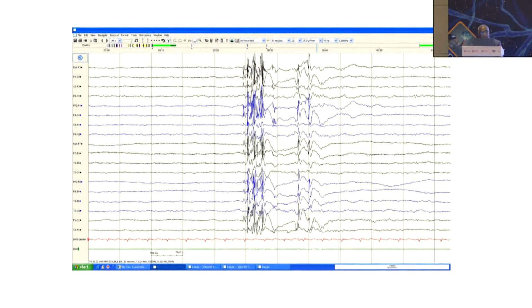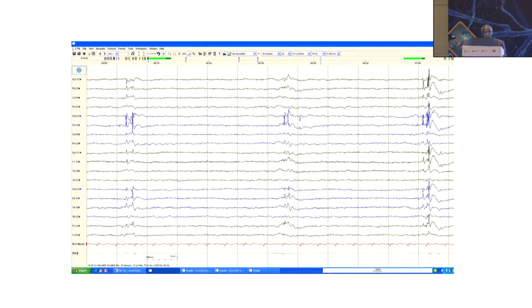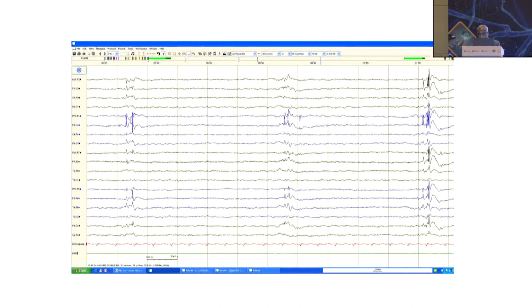Here you know that the alpha activity has gone and some theta waves are coming, so the patient is drowsy, and in addition, here there are polyspikes. Bursts are seen, and there are some spike discharges also. Here the patient has gone into deeper stages where these things are getting fragmented, they are asymmetric, and seen in the frontal region, and some are generalized.